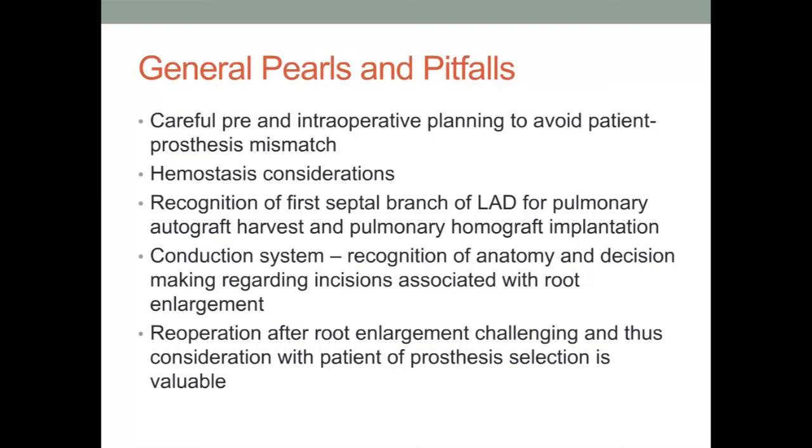Due to the extensive surgical reconstruction and associated suture lines, appropriate blood pressure management in the immediate post-procedural time, as well as the potential employment of hemostatic agents, should be carefully considered. A thorough survey of all suture lines, especially those located in the difficult to reach and visualize posterior locations and around the coronary buttons, should be completed prior to administration of protamine and other blood products.